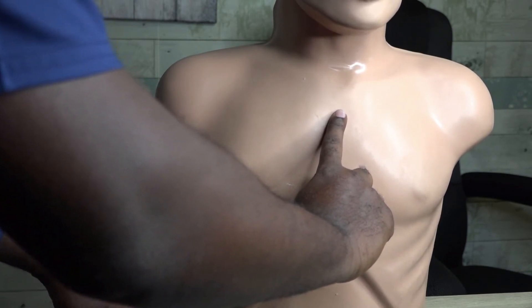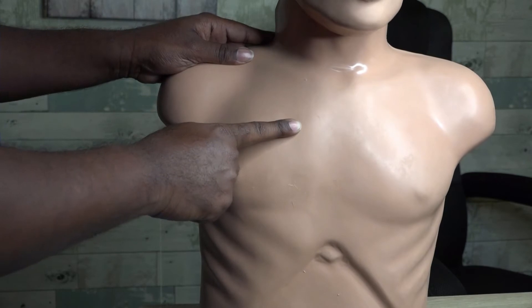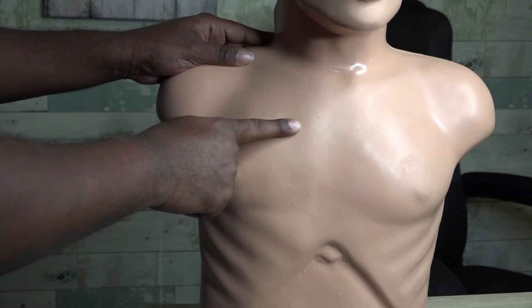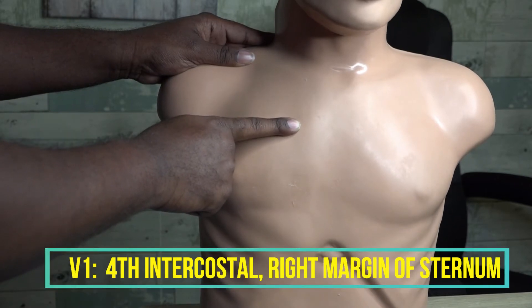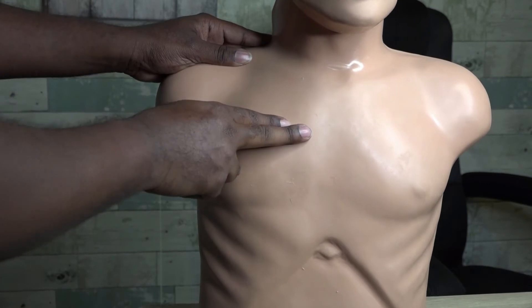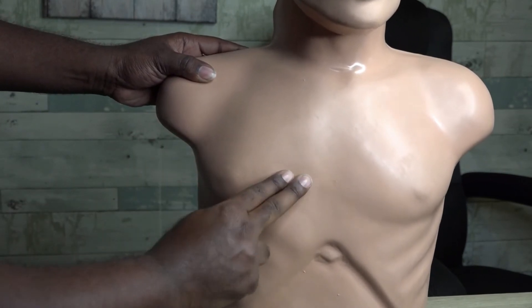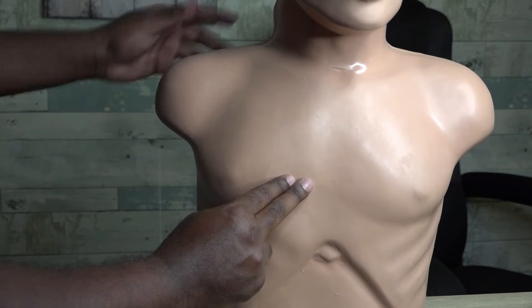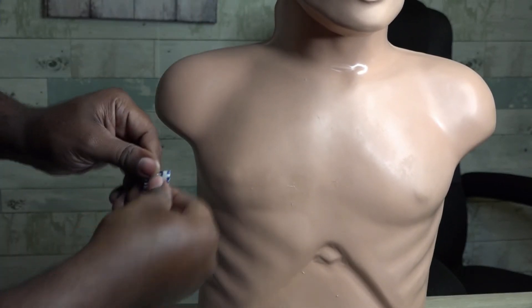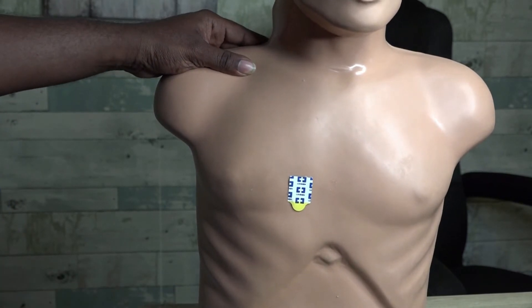V1 is going to go to the right of the sternum. Starting at the second intercostal space, we count down: two, three, four — that fourth intercostal space at the right margin of the sternum is exactly where V1 is located. I'm going to place V1 right in this area.